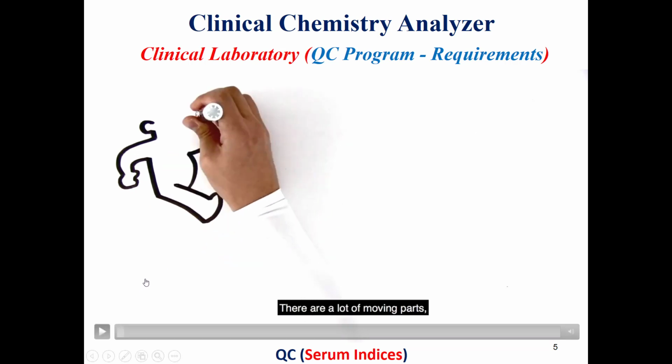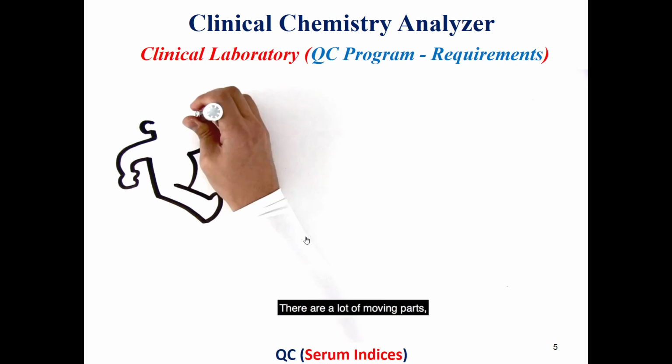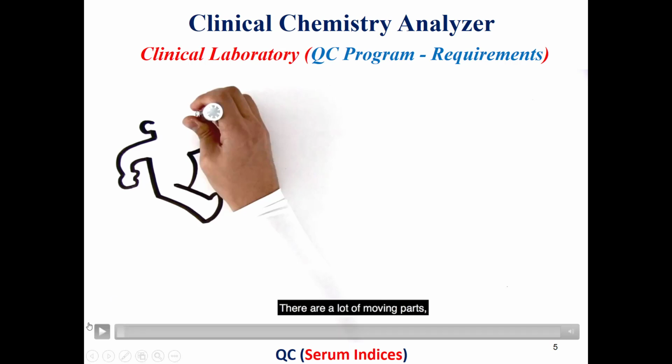Now we will watch a small video which talks about the quality control program, if it's an external one or internal one, and here the video will be specified about the external one, and especially about the use of the serum indices which are manufactured by a third party in order to evaluate the performance of our clinical chemistry analyzer.